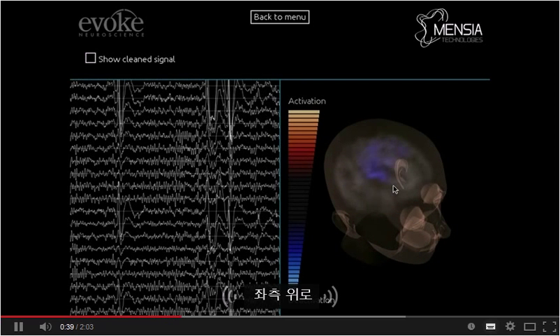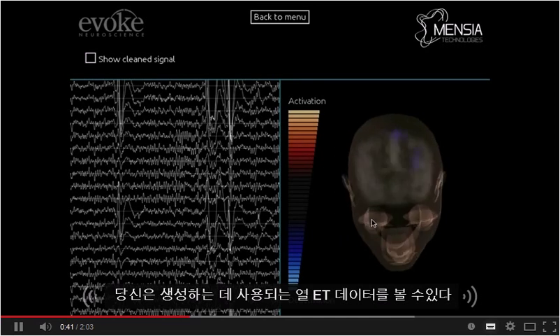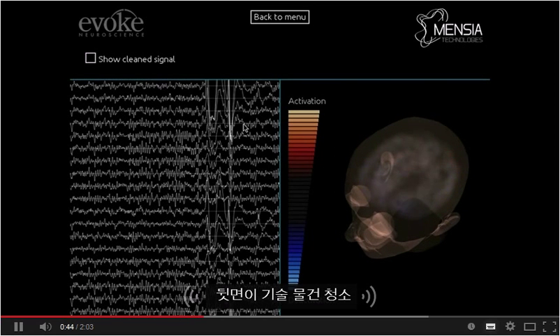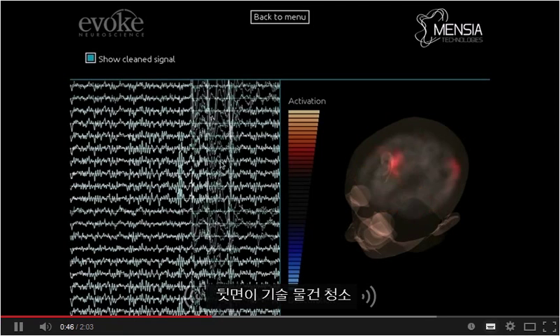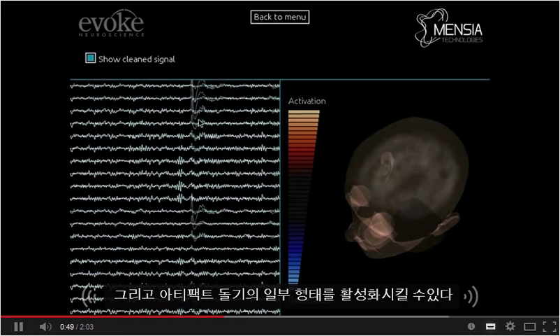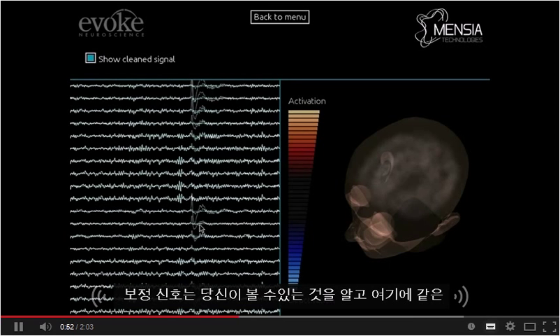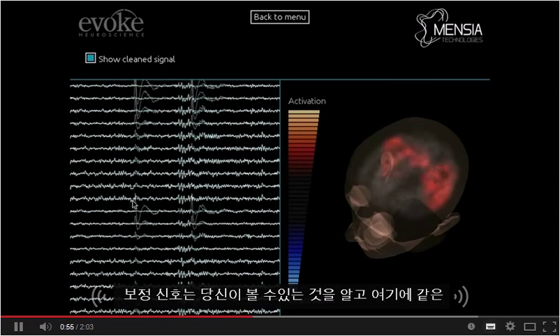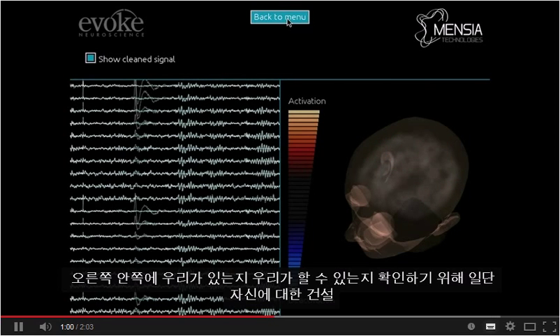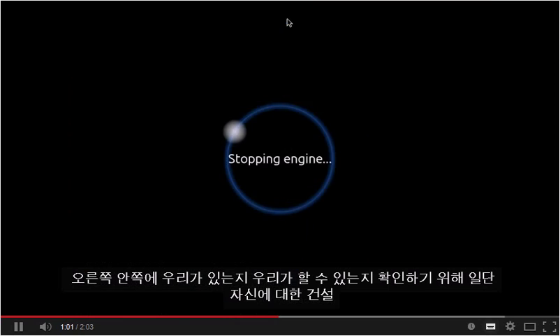On the left-hand side, you can see the raw EEG data that is used to generate this map. This signal is not cleaned, and it is possible to activate some form of artifact projection and correction of the signal, as you can see here. Such denoising of the data is going to dramatically improve the quality of the reconstruction you can see on the right-hand side.